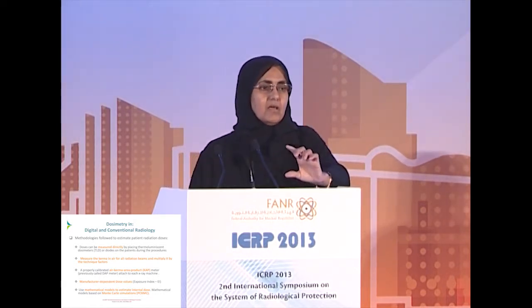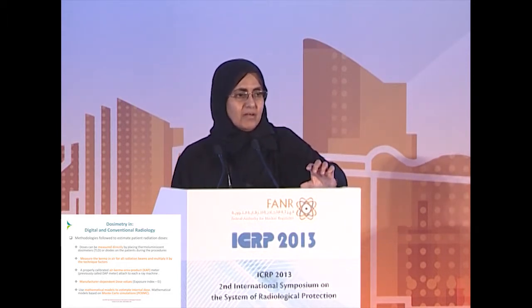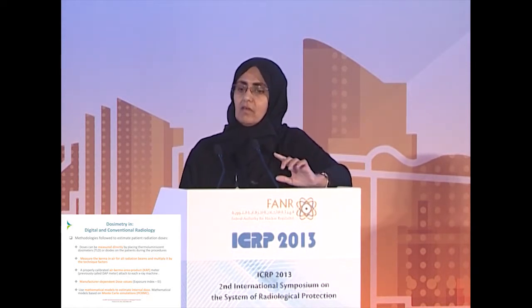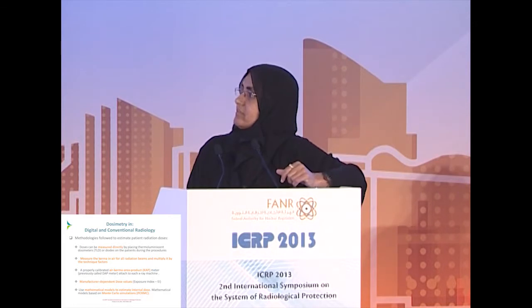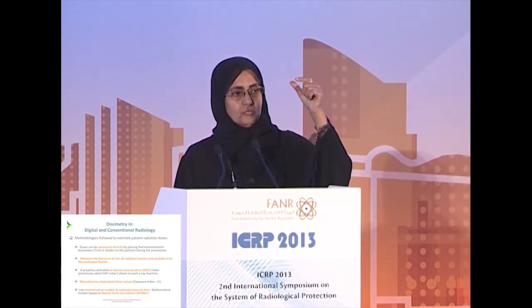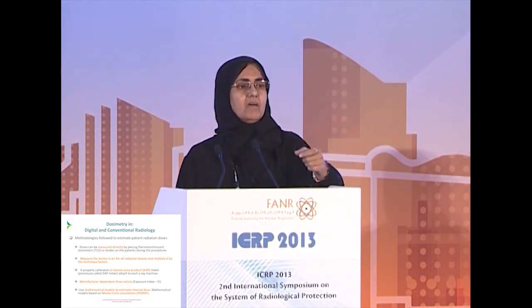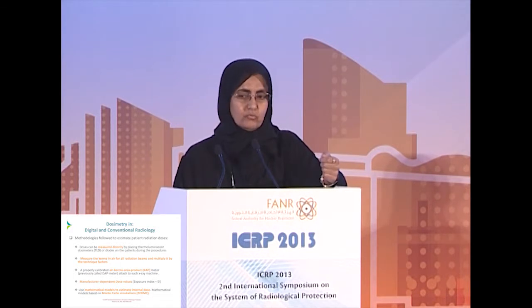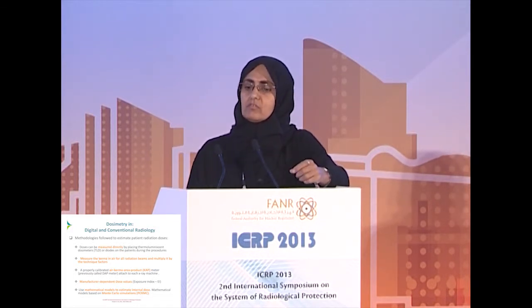This is mainly described in the IAEA Technical Report Series number 457, so the methodology is explained there. Also, the availability of dosimetry devices within recent equipment can give us an indication of those values.